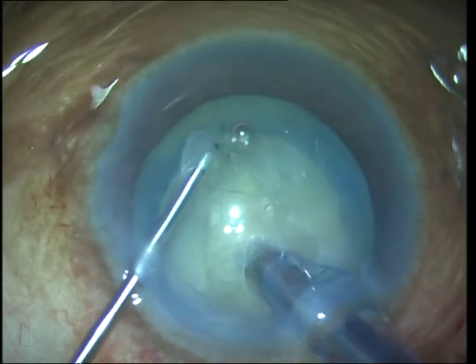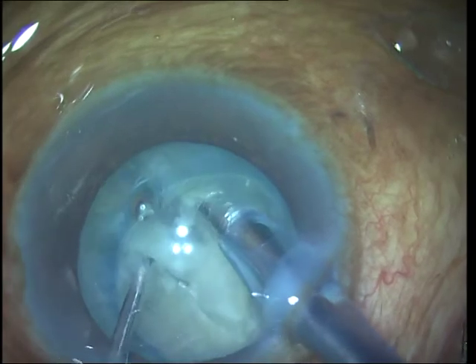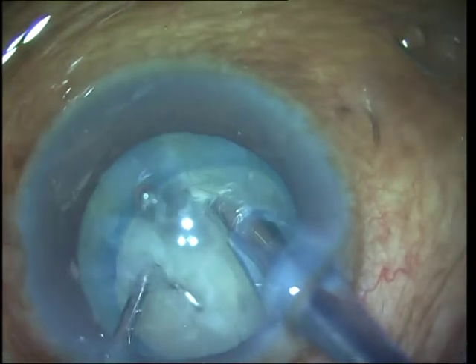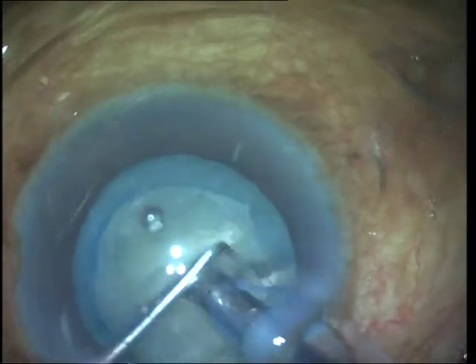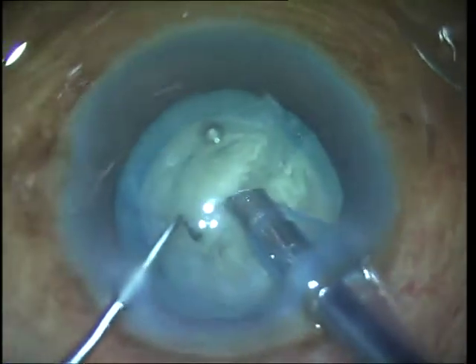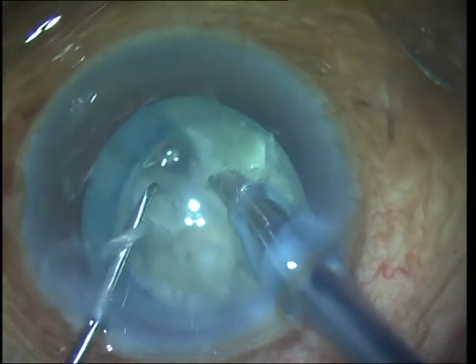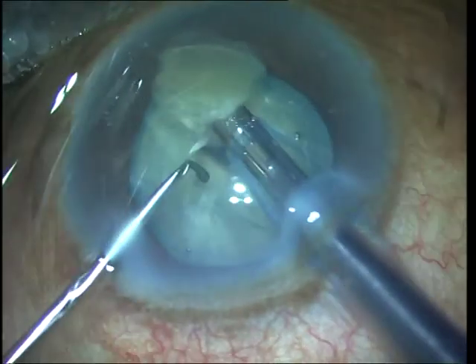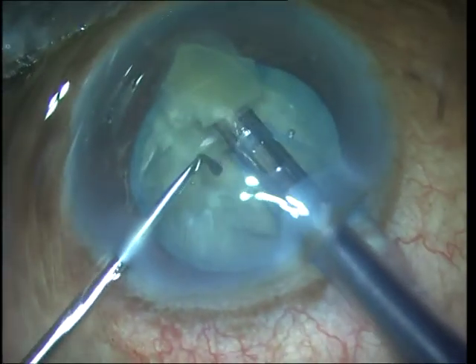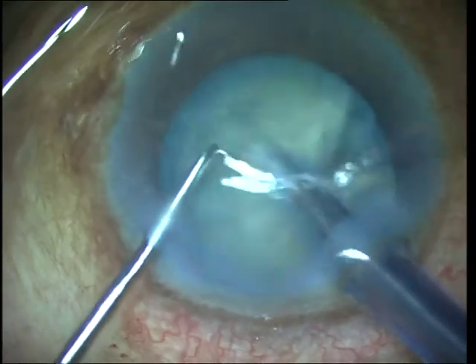When performing a horizontal chop for white cataracts it should be remembered that the cataract fills up the capsular bag almost completely, and therefore inserting the horizontal chopper into the space under the anterior capsule should be done carefully, taking care not to damage the capsulo-zonular complex inadvertently. The nucleus is embedded firmly with the phaco tip and the horizontal chopper is a blunt tip chopper.